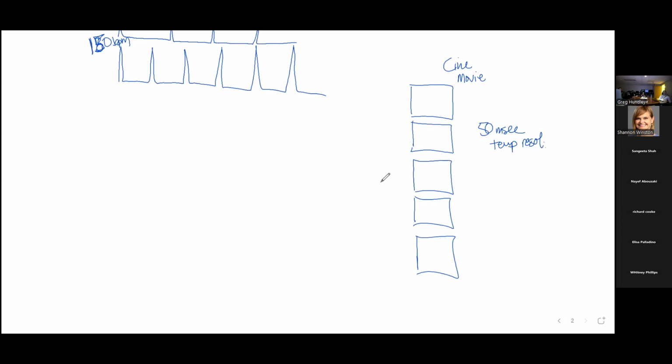And we were capturing in this interval of time a lot of information, coming over and flooding the frame of the movie. We were getting 1, 2, 3, 4, 5, whatever it is, pieces of information really quickly. So what was the duration of the breath hold? They're usually 8 to 10 seconds, right?